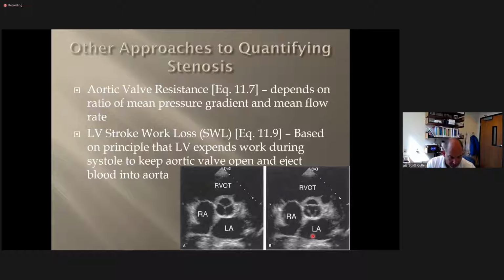So every aortic valve study you get, going back to Irina's point about the competency exam, if I ask you for an aortic valve study, you definitely have to be taking your LVOT diameter. You need to take your pulse wave and trace it. You need to take your CW and at least get a max velocity, if not a tracing of that. That's what I need to have in my echo to be able to even get a valve area. If I don't get that, I did not do the job that I need to do.